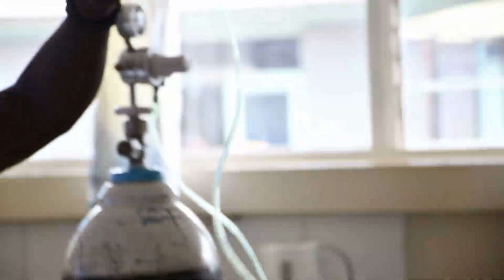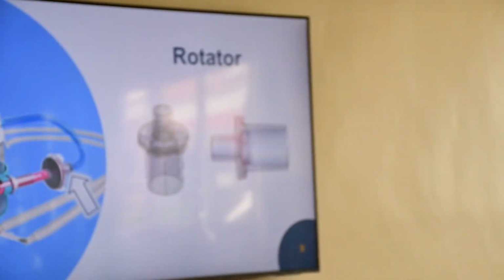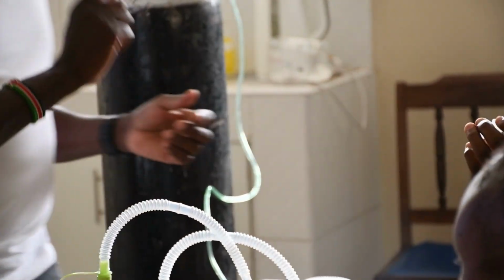So we have arrived there. Okay. After that there is something called a rotator. So the rotator is like a small gadget.